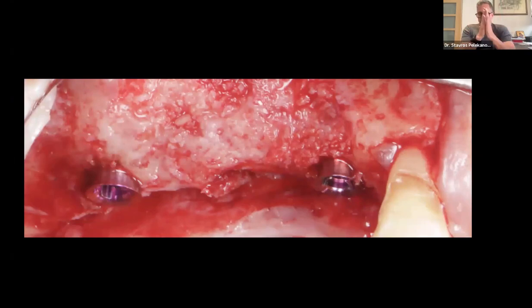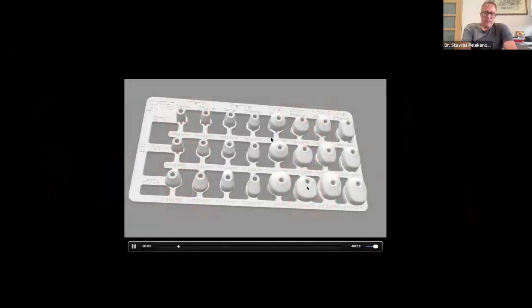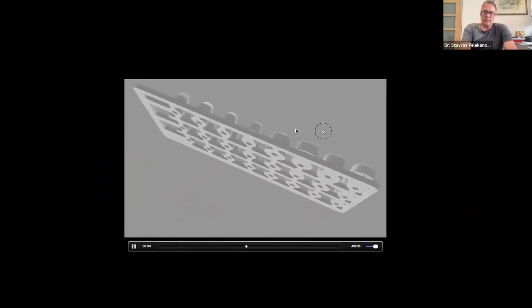So most of the time, the neck of the implant is supracrestal, but there is nothing wrong with placing this part of the implant into the bone in cases where we don't have enough soft tissue height. And of course, it can be used immediate or late, and most of the time we can place immediately a prefabricated abutment.